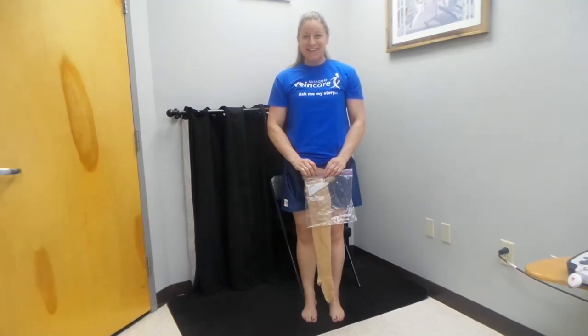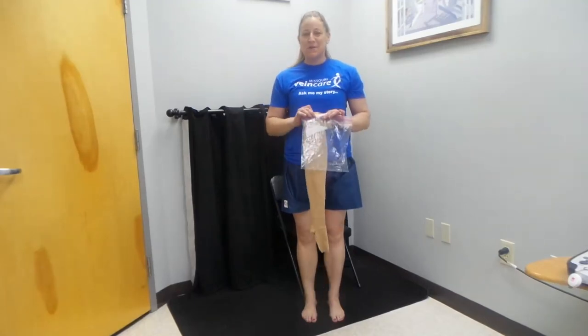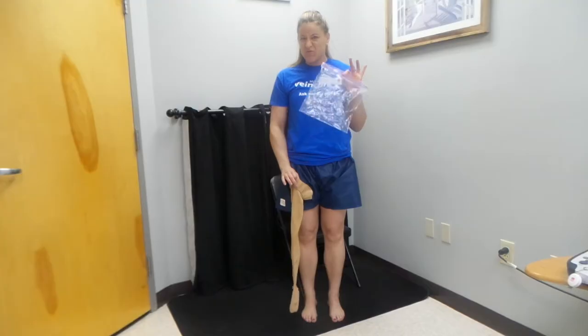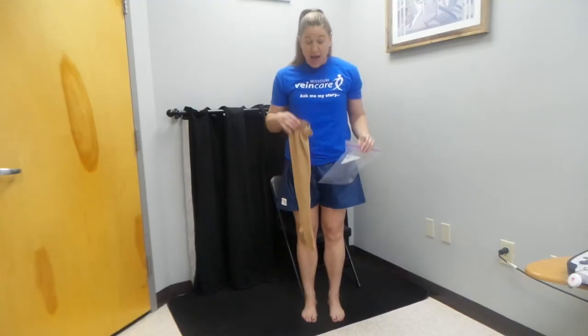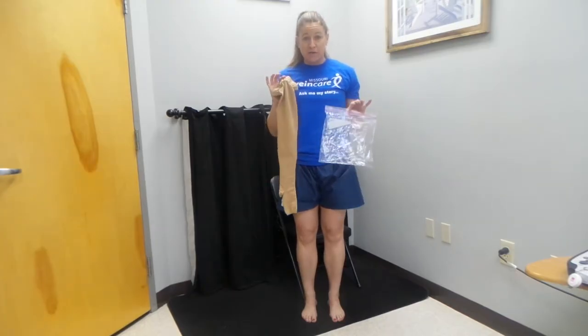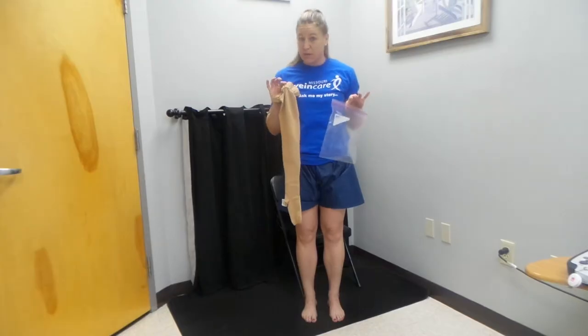Hello, Gintry with Missouri Veincare here with another tip on how to put on your compression stockings. You'll notice I have a ziplock bag — this is pretty interesting. I also have my stocking here. Make sure you have open-toed stockings for this version, for this tip that we're going to give you right here.